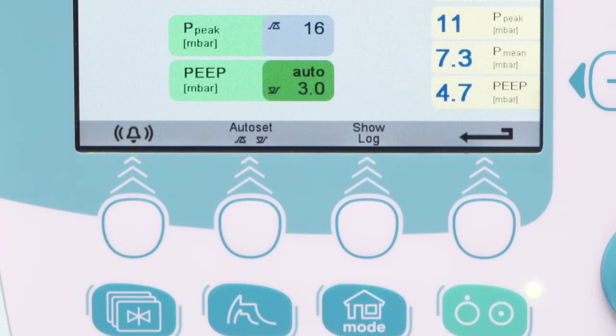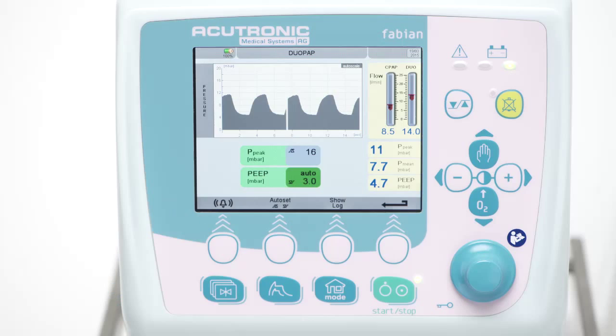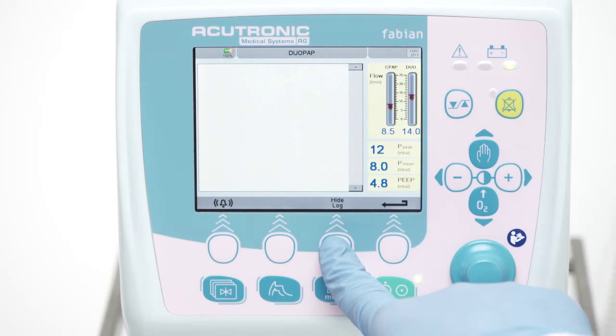A log of warnings and alarm events, if any, including date and time of recording, is available by pushing the show log button.